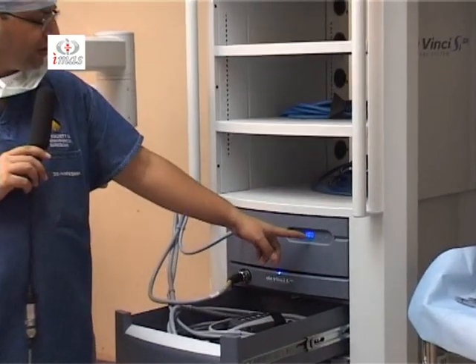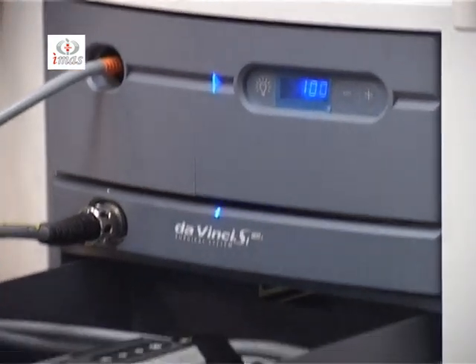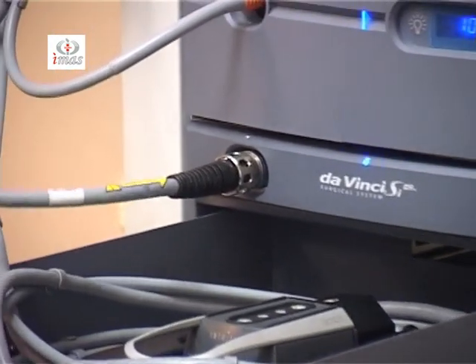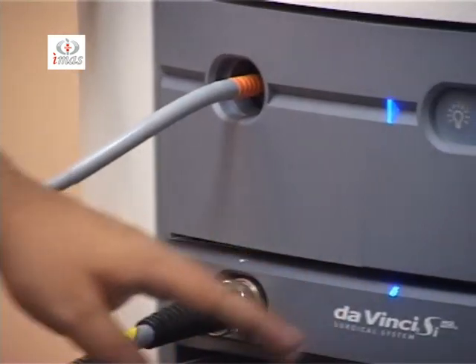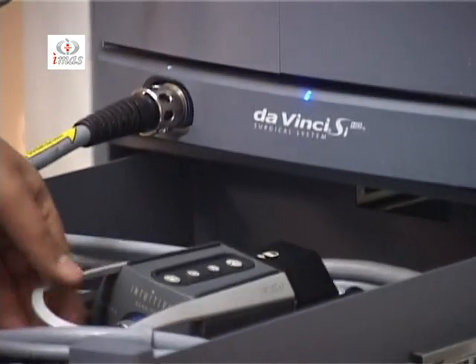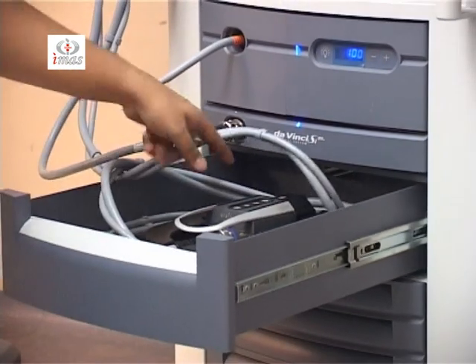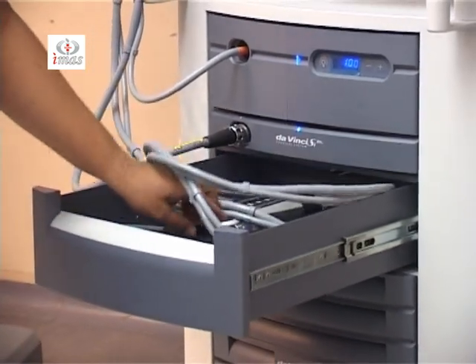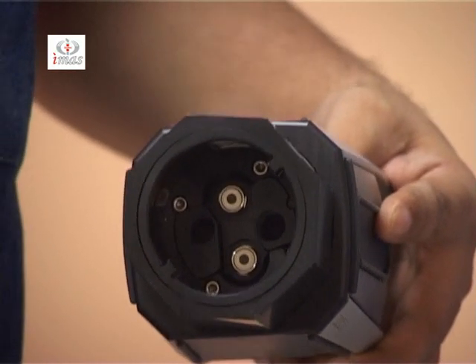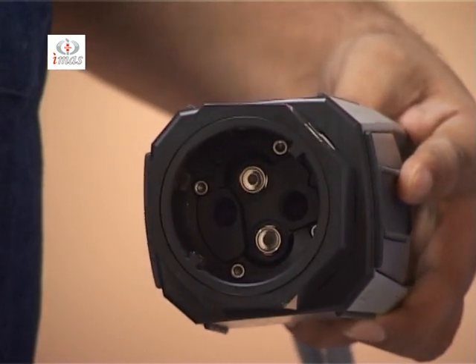The setting has to be kept at 100 almost always. This is the camera control unit cable, in which there are two camera control units inside this one CCU. And this is the drawer to keep the camera head. If you take out this camera head, the two eyes provide a three-dimensional view of the surgical field.